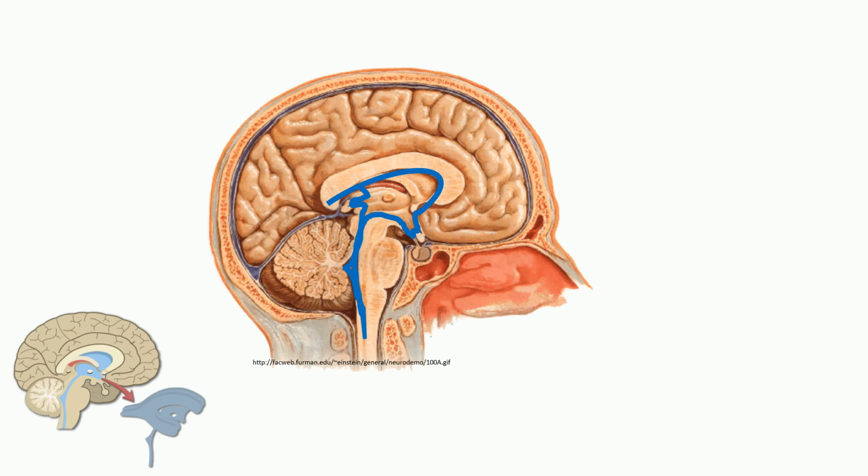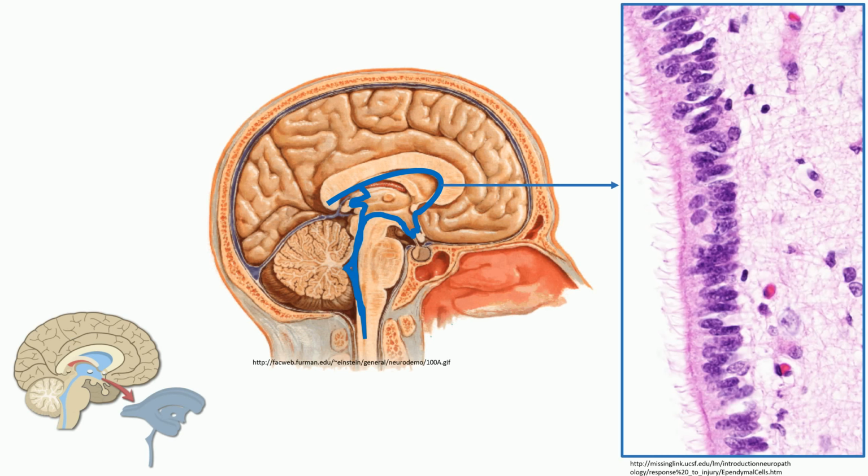The ventricles are lined by very specialized cells called ependymal cells. Ependymal cells are these epithelial-looking type cells that have this ciliated apical surface. The ependymal cells are specialized cells that can give rise to ependymomas. Also in this region, you can also have subependymomas arising here as well.